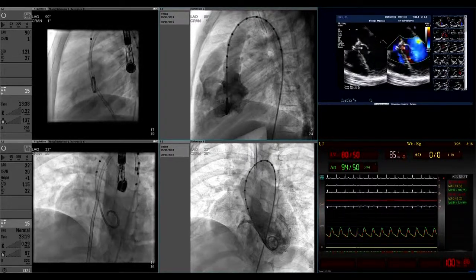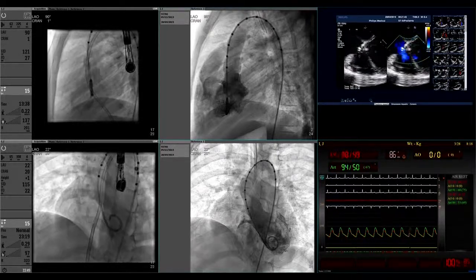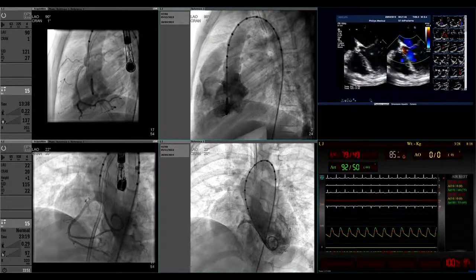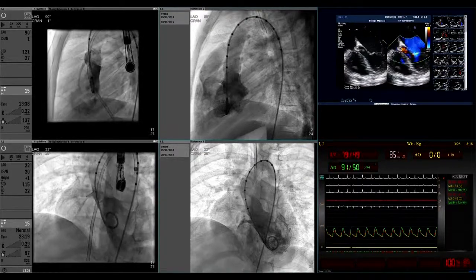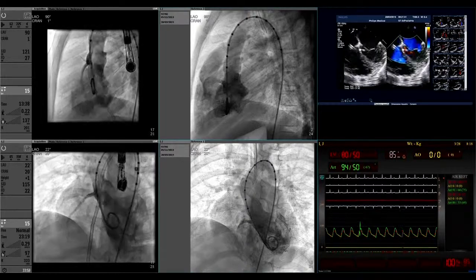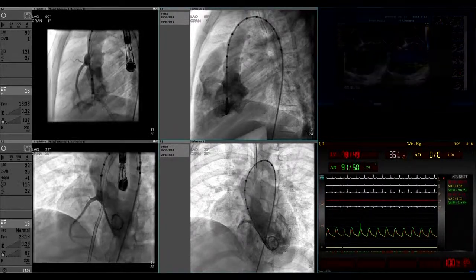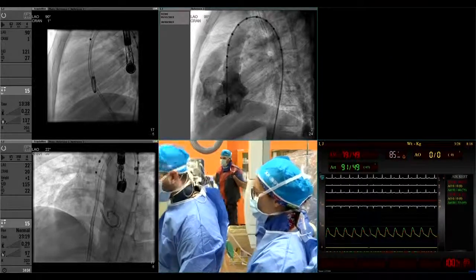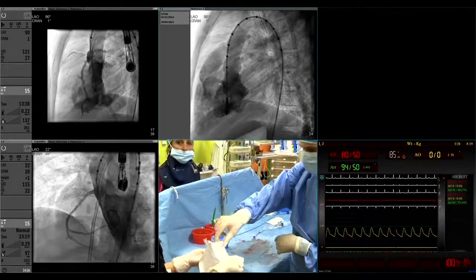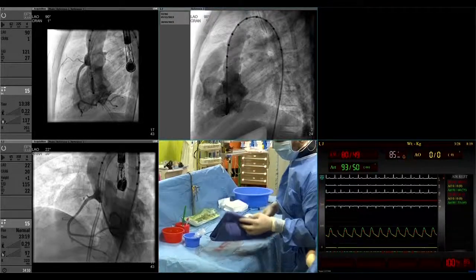Yeah, you know, the LifeTech devices are available, and similarly the Occlutech device would work here, but maybe a 5mm symmetric LifeTech would be fine here too. Yeah, I agree. And they are soft as well, so the problem of AV block probably will be lesser. Maybe the ADO1 is cheaper. I don't know.